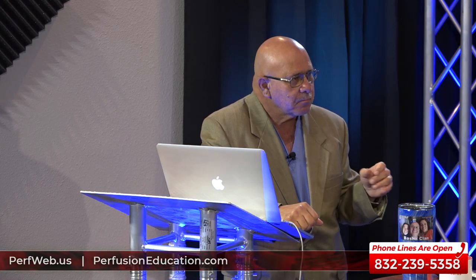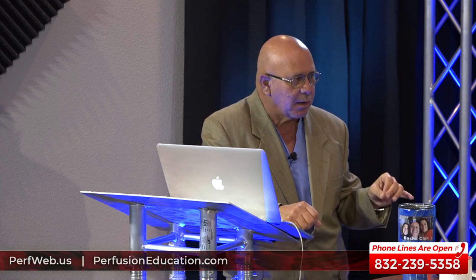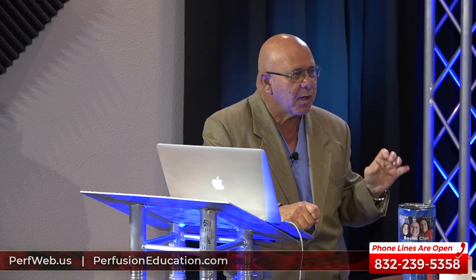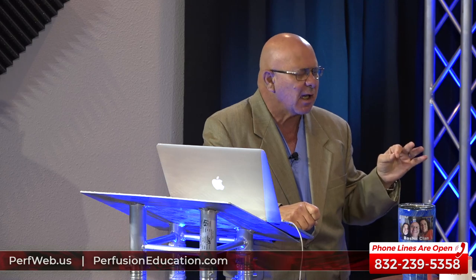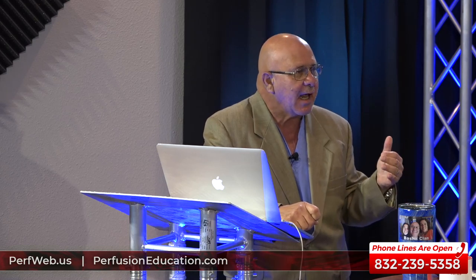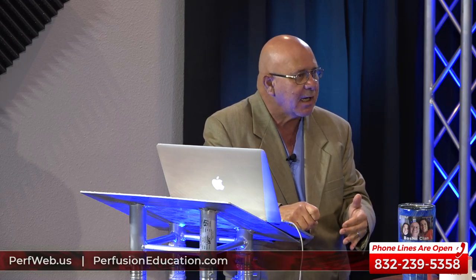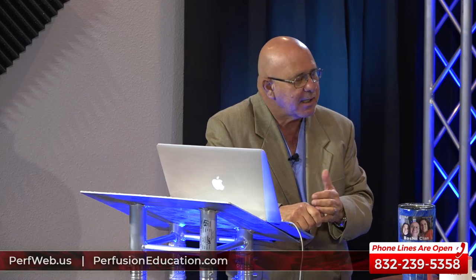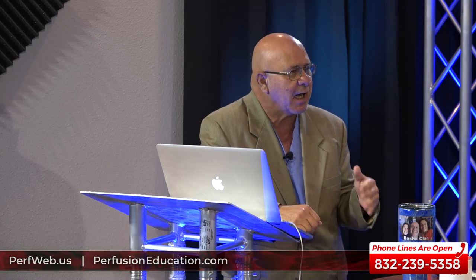What was the reason for it coming off the market? The stated reason was because it was coated with heparin and that it didn't have the proper FDA approval, because it was technically a drug-eluting device. It had to go through a different set of scrutiny by the FDA, and Edwards said, we're not spending the money on it, and they just took it off the market. It was just because it had heparin on it. If it didn't have heparin on it, then it wouldn't have been an issue. Its approval was not based on it having a heparin coating. Oh, I see. Okay, that's what I heard.